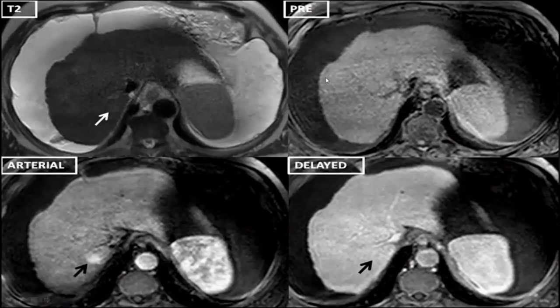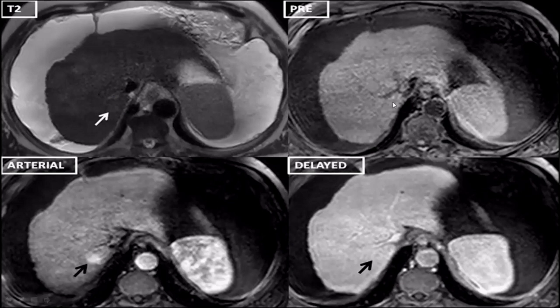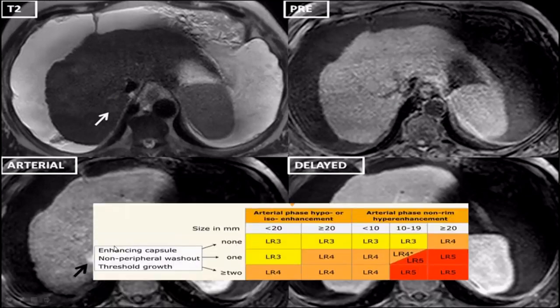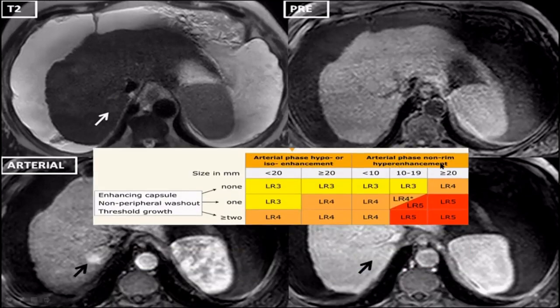In this interesting case, there is irregular liver margin and a hyperenhancing lesion in arterial phase. The lesion is barely visible on T2 or T1 weighted images, and there is no washout on delayed images. Only the arterial phase shows a hyperenhancing lesion between 10 to 19 mm. According to the table, it shows arterial phase non-rim hyperenhancement but none of the additional features — no enhancing capsule, no non-peripheral washout, no threshold growth — so it falls into LR-3.